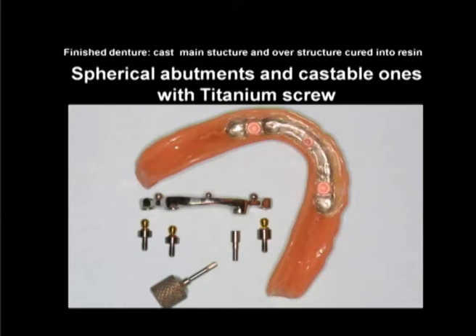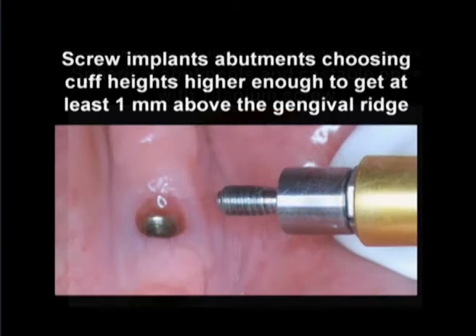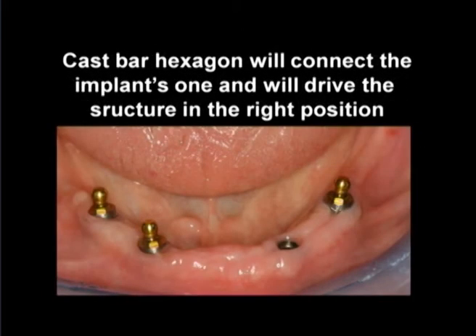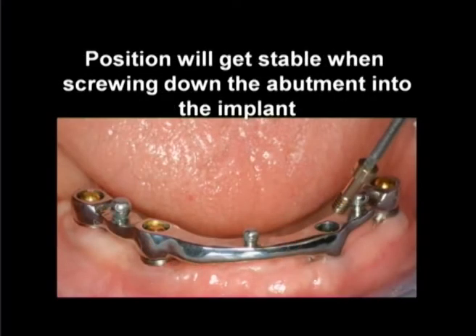Cast bar supported denture. 3 spheroblock titanium abutments with 1 screw. Screw titanium sphere abutments into implants using the proper universal screwdriver tool. Insert bar. Annular blocks will position automatically over the spheres. Cast bar's hexagon will connect with the implant's hexagon, and by tightening down the screw, passive position will be found.